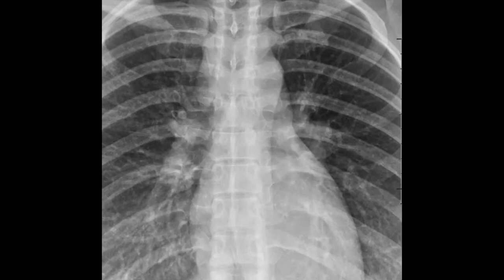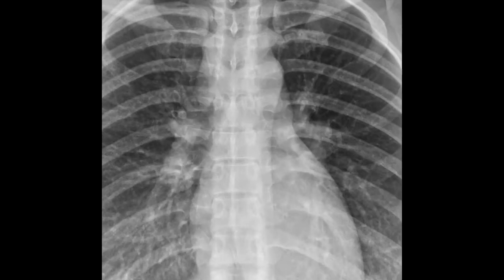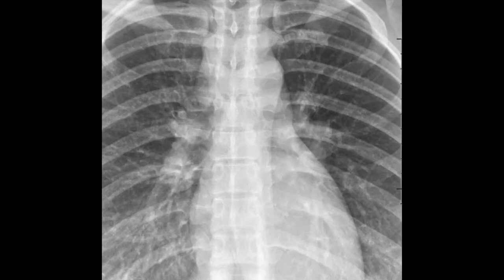In this young woman in her early thirties, we really don't expect to see any convexity here. This should be flat, if not a little bit concave. Also in the left hilar region, if we window it, maybe there's a little bit of abnormal convexity here, maybe inferiorly. Certainly down here it looks like there's convexity and a little bit of general fullness.